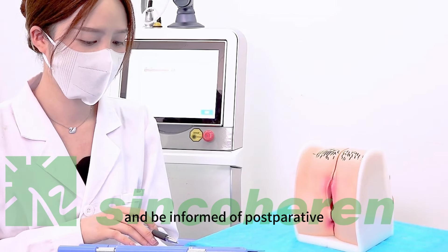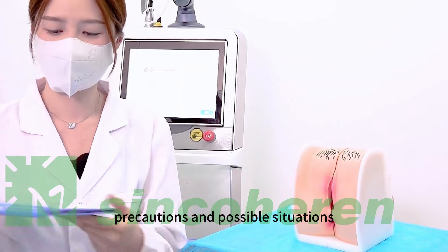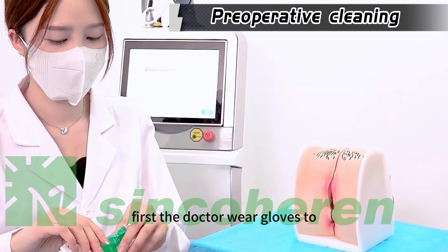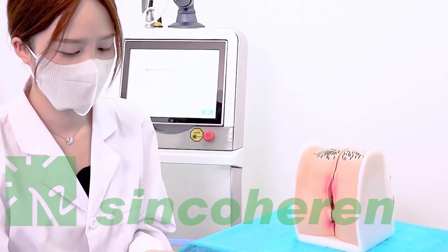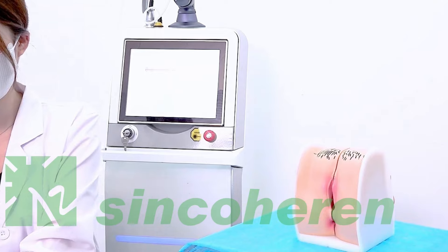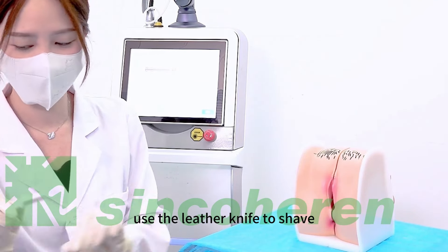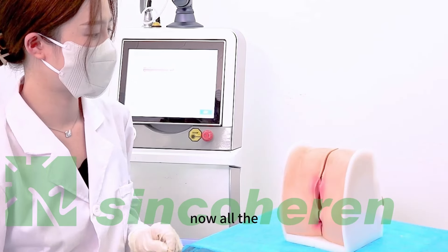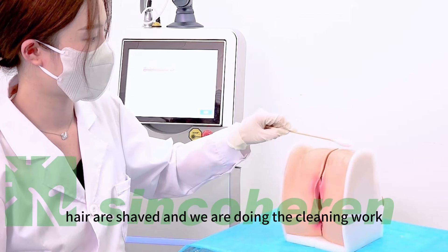Before the treatment, the patient should be informed of the contraindications, sign the agreement, and be informed of postoperative precautions and possible situations. First, the doctor wears gloves and uses the razor to shave the hair in the treatment area.